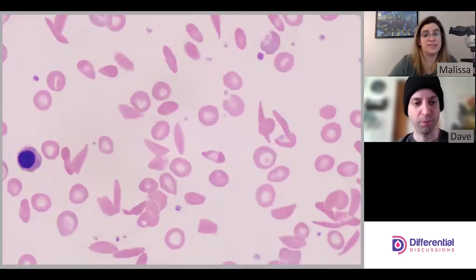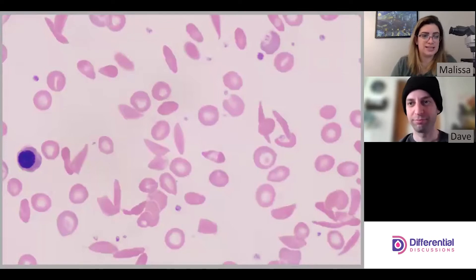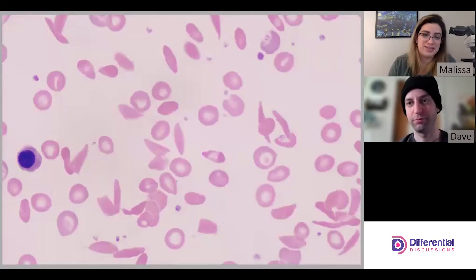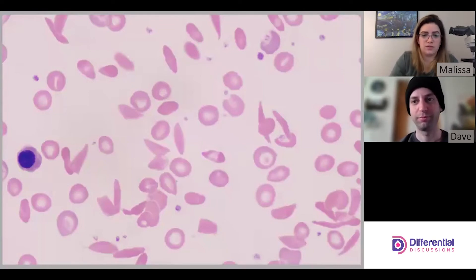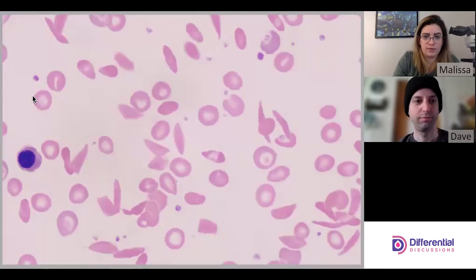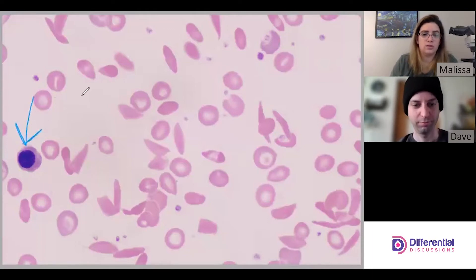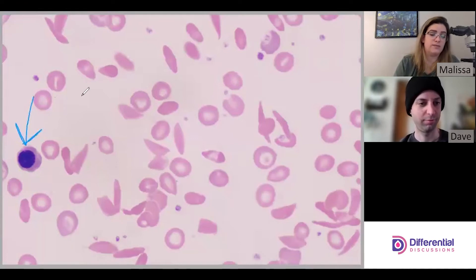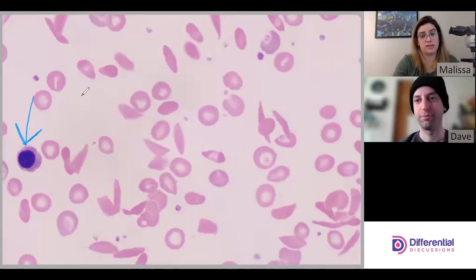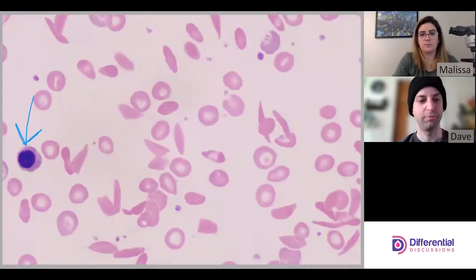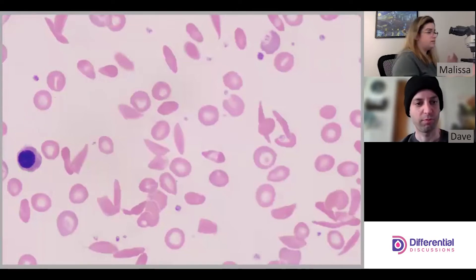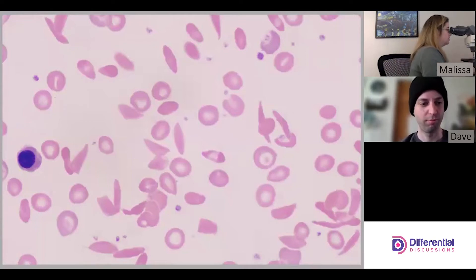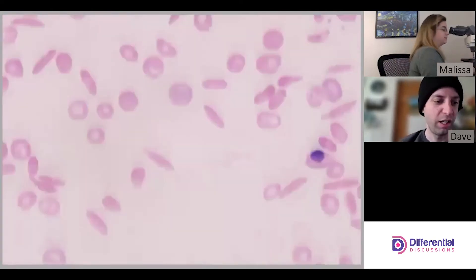What we have here is a slide with a really good strong sickle cell disease case — they'll typically have nRBCs, sometimes a lot of them. You can see here, for example, this is an nRBC. When we do our differential, we tally the number of nRBCs we see and then correct for their presence.